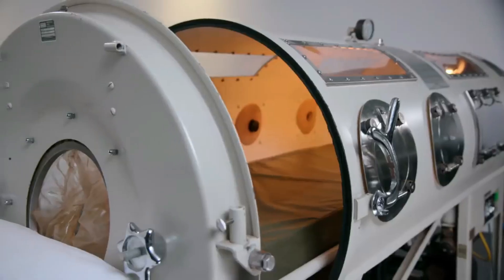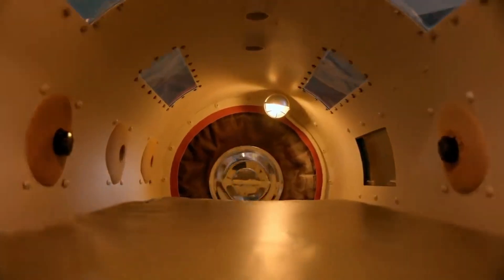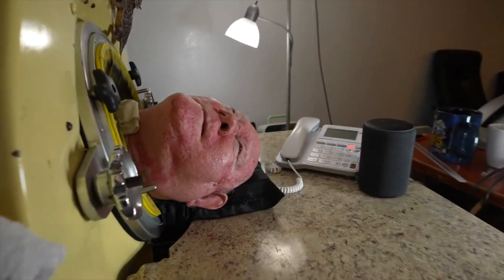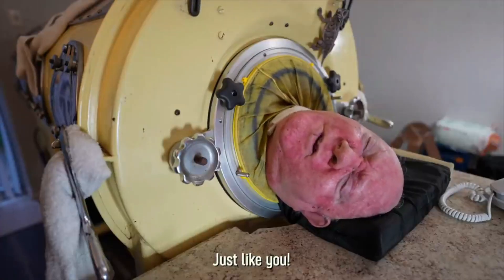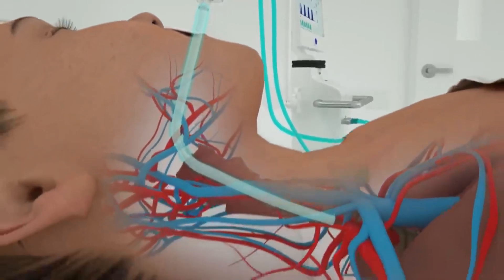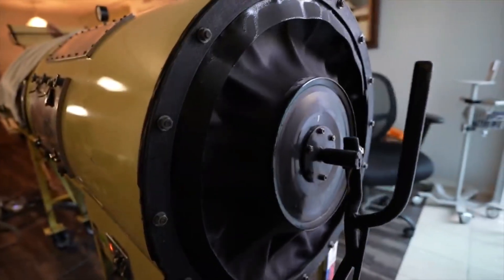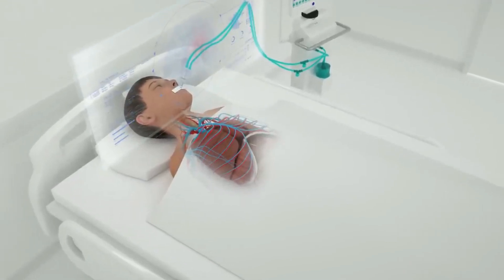In contrast, modern-day ventilators use an entirely different mechanism. These machines are smaller, portable, and can be used to treat various respiratory conditions. Ventilators typically consist of a pump, oxygen supply, and tubing that delivers air to the patient's lungs. They can be programmed to deliver different amounts of air and oxygen at specific intervals, depending on the patient's needs. One significant difference between the two devices is the level of control they offer — ventilators can be precisely programmed, whereas iron lungs rely on the natural pressure of the chamber, making ventilators more adaptable.